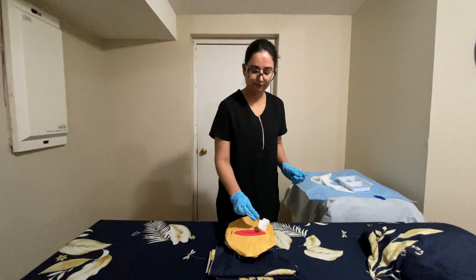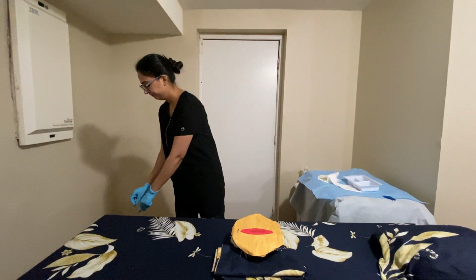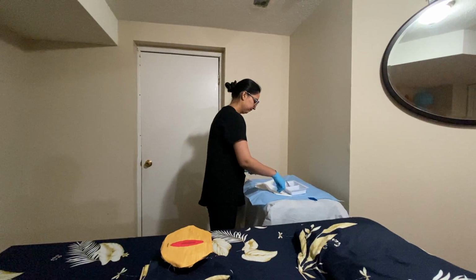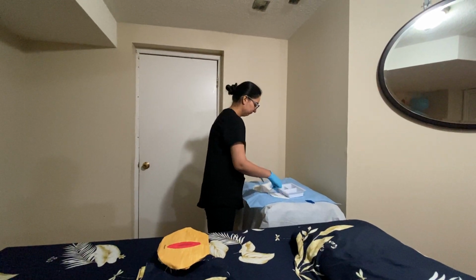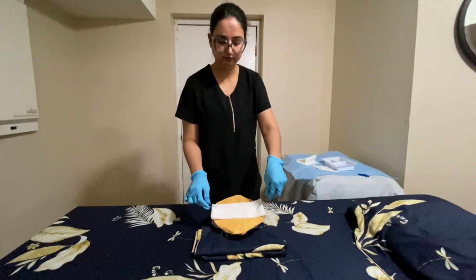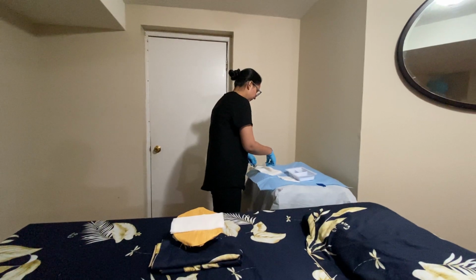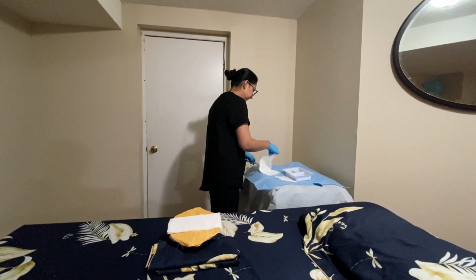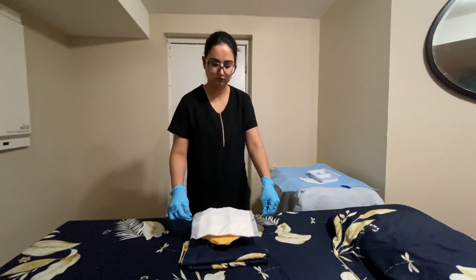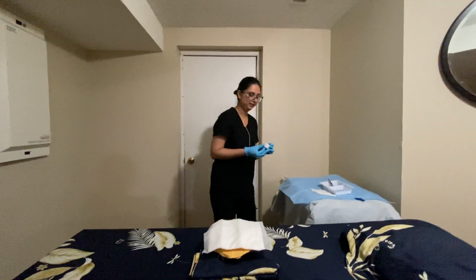Now to the periphery which is closest to my body and head to toe similarly. Placing the sterile gauze. Now placing the absorbent pad. Securing the wound with the adhesive tape.